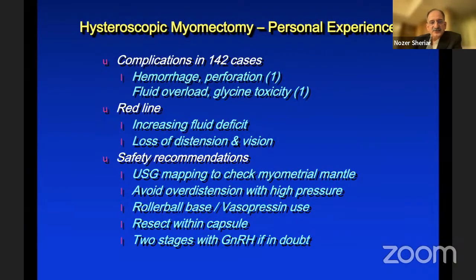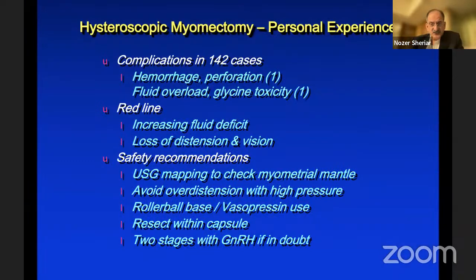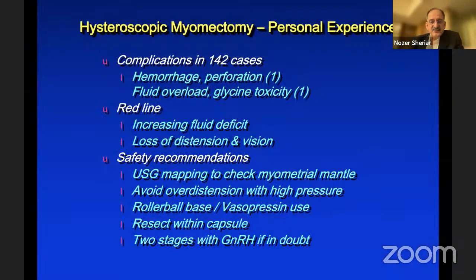Complications, primarily hemorrhage. And if there is a lot of hemorrhage and you can't see anything at some point in time, be patient, wait, do a bimanual massage. Obviously, by now, you've already given her tranexamic acid, and use an intrauterine balloon if at the end of the procedure you've got vessels. 12 French Foley's catheter, knock off the tip, put it in, but please don't over distend the bulb.